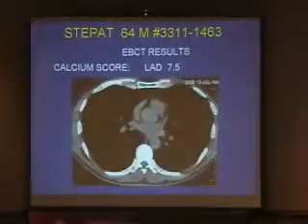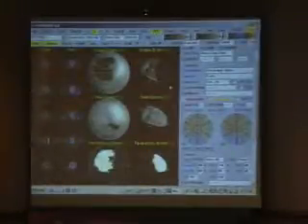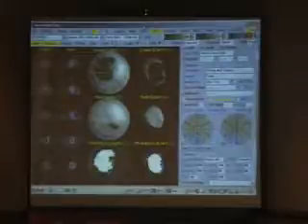The last case I could show you here is a patient who comes in, but he's got angina. And he has a result on his nuclear study showing this finding, where the left anterior descending coronary territory is essentially missing. You can define this quantitatively as a very large defect throughout the left anterior descending coronary territory, and it's associated with abnormal contraction in the LAD at stress compared to rest.